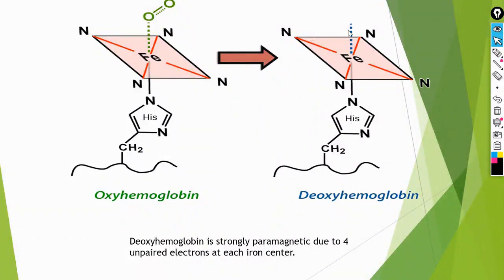This inhomogeneity makes one proton exposed to a higher magnetic field than another, causing it to precess faster and move away, leading to a divergence that results in a signal loss. Now, if the opposite happens, with a high presence of oxygenated hemoglobin and no free electrons, there will be no divergence, and thus there will be no signal loss.